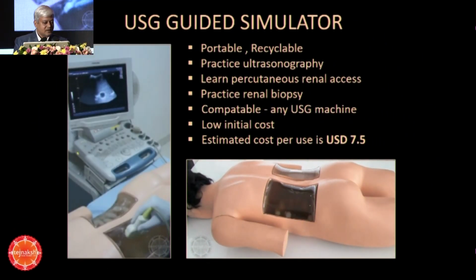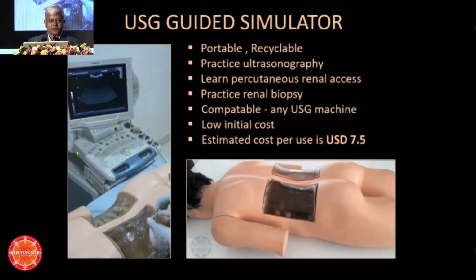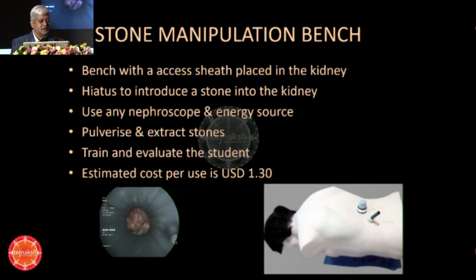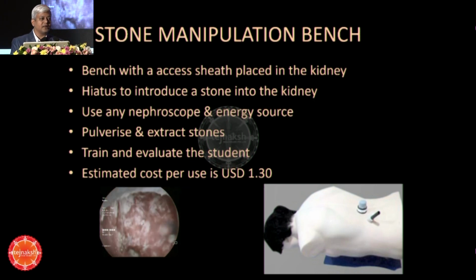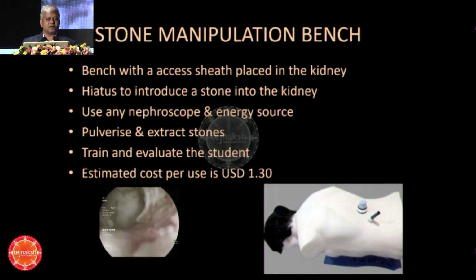The ultrasound-guided simulator for renal access also simulates the real tissue feel, and the student can practice puncture, and even renal biopsy can be practiced. The next step for teaching is the stone manipulation bench, in which the student can learn how to manipulate the stone in a real-time fashion. This can be practiced in the OR.